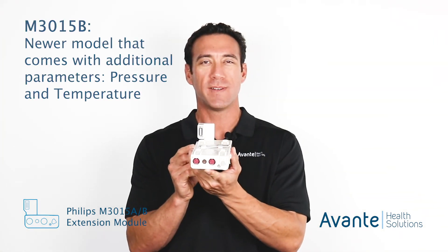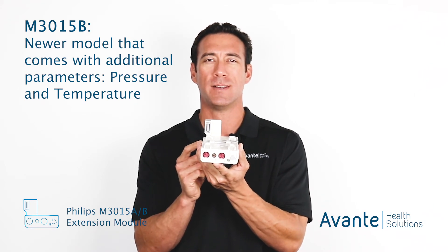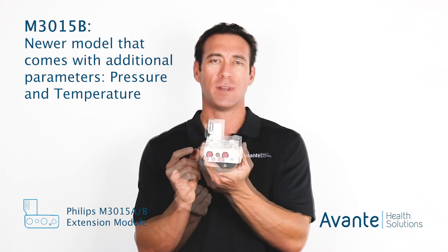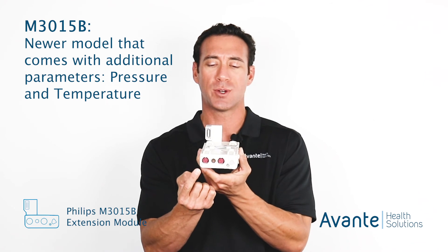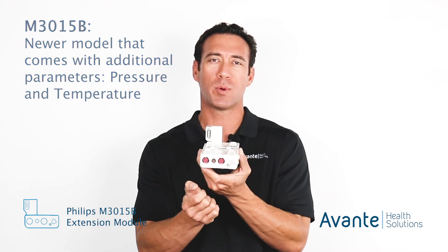The M3015B also comes with additional measurements beside the ETCO2 measurement. You get two additional pressure ports and also one additional temperature port.